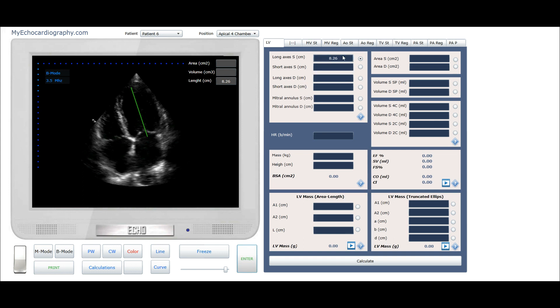Let's assess the systolic short axis of the left ventricle. We have to divide the long axis into three equal parts, and the short axis line has to cross the third point.